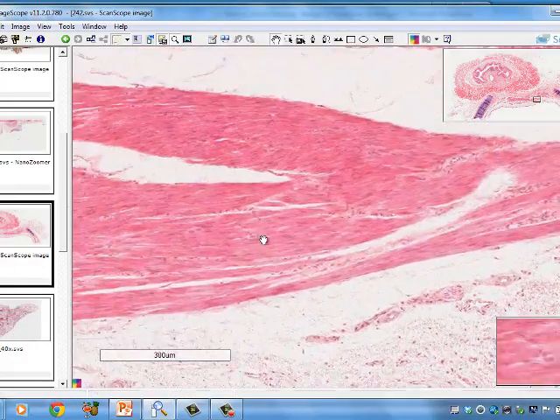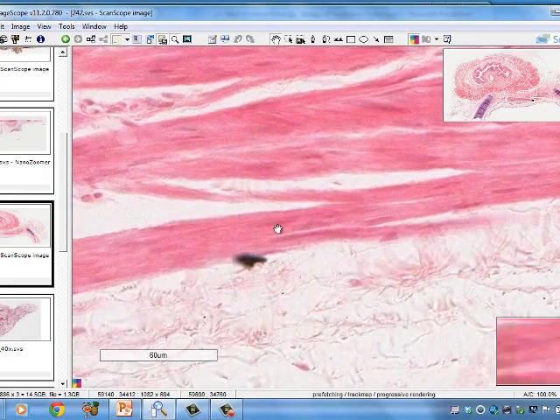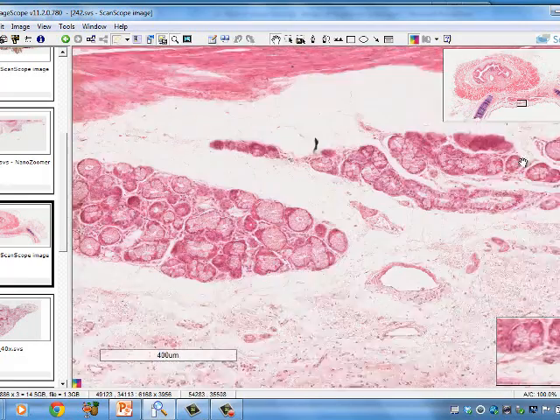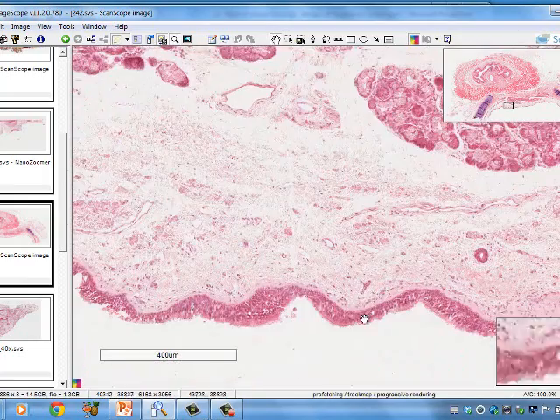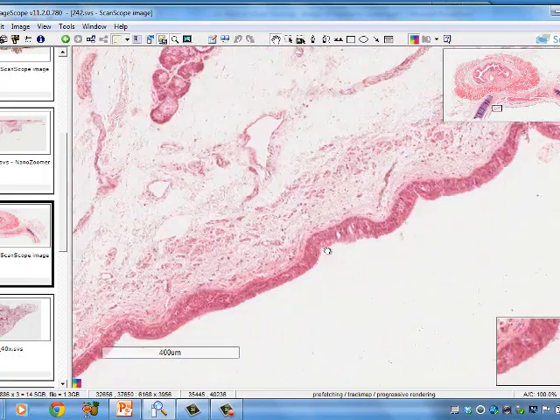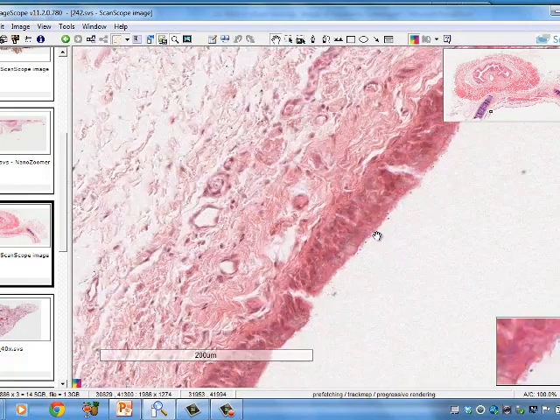And we can see the muscle. If we look in there, we can see this is actually smooth muscle, with long nuclei in the center and cigar-shaped cells. We also have the submucosal glands right in through there. That's the glands below this epithelium and within the connective tissue as well. Again, we'll have a respiratory epithelium because that's what lines the conducting portion of the respiratory system.